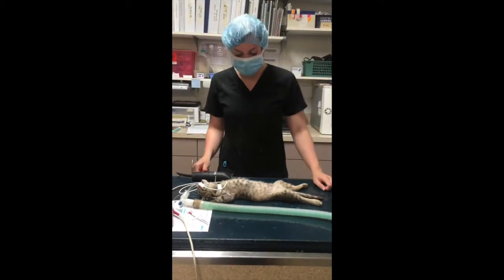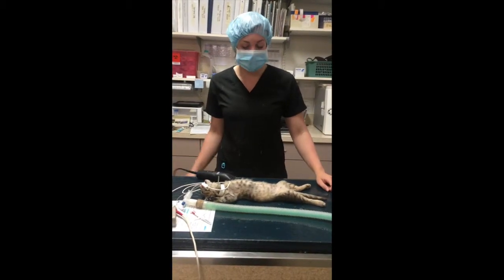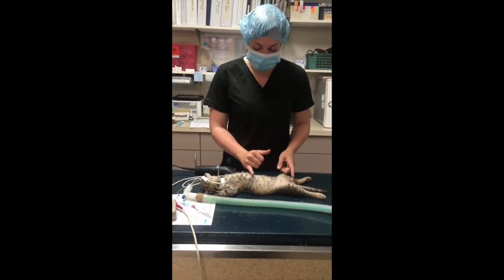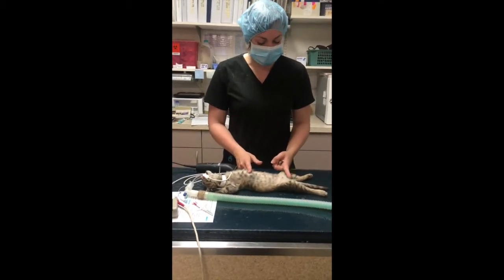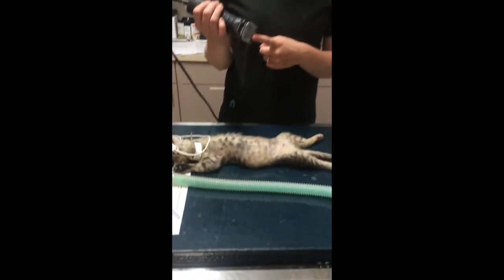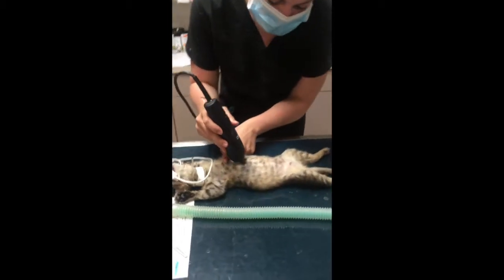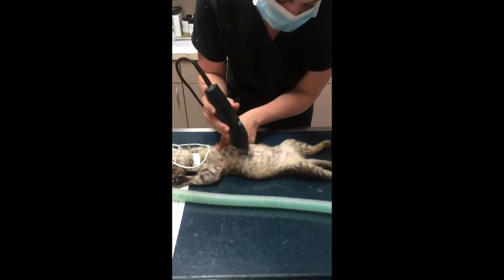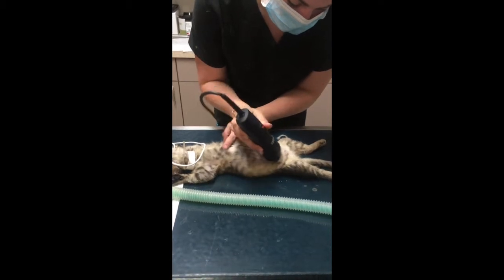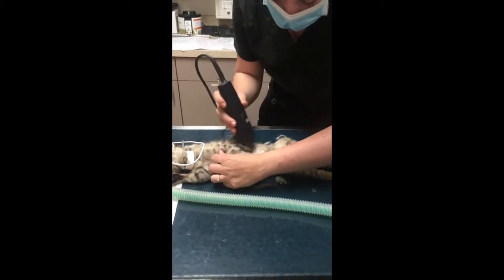All right, I'm going to be demonstrating how to shave a cat for a spay surgery. When you're shaving, you want to shave from the xiphoid process all the way down to the pubic area. So you want to take your clippers with a size 40 blade, hold them at the appropriate angle, and gently shave away the hair.